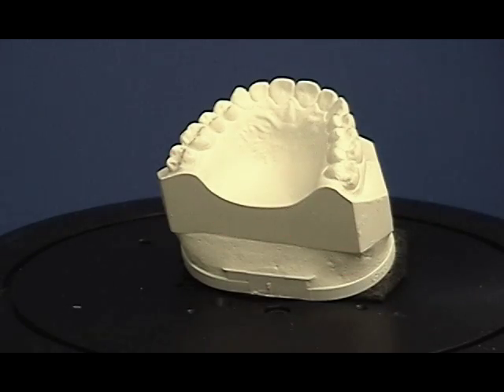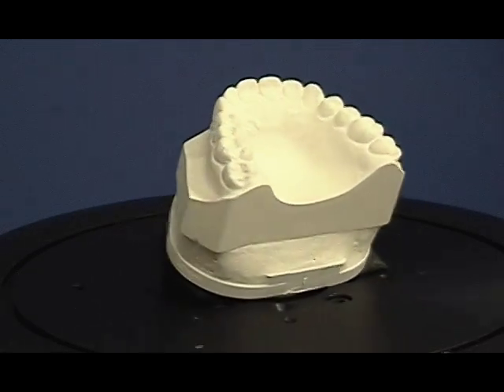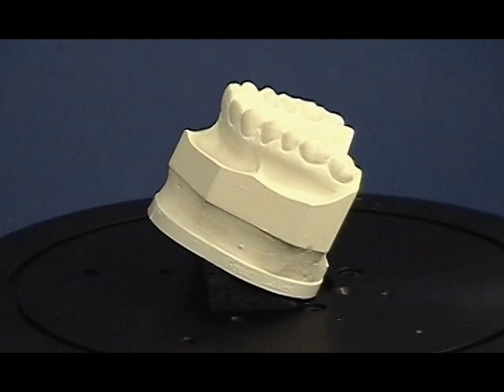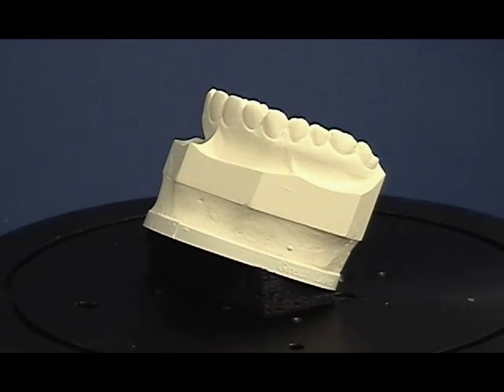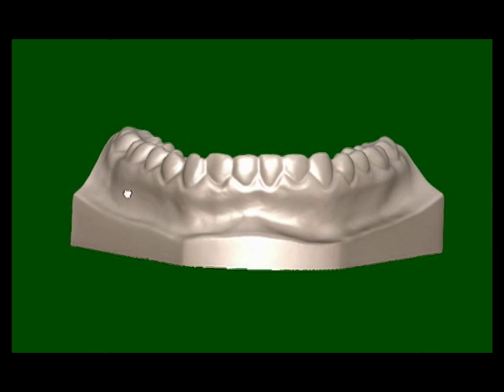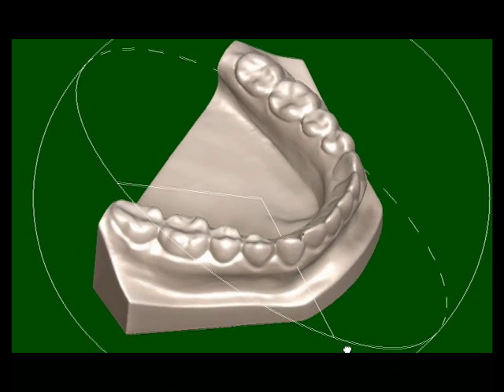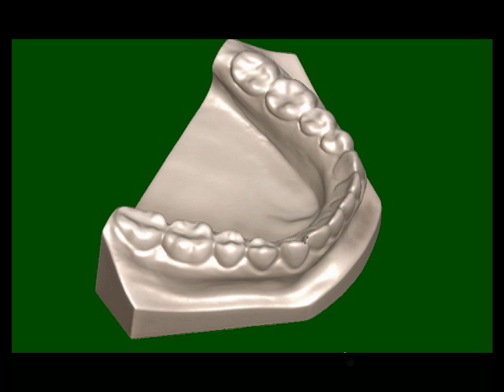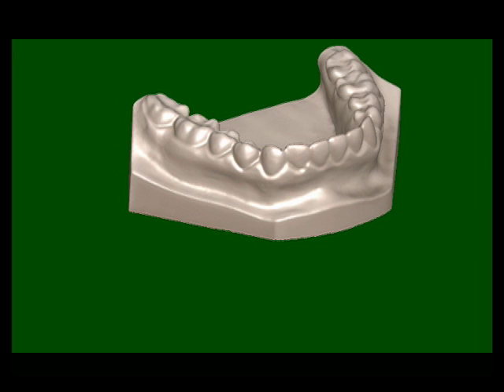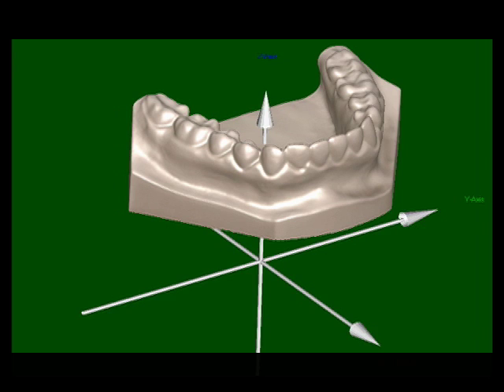The process starts by laser scanning upper and lower plaster models. This results in a three-dimensional model of the upper and lower arches. The models are calibrated with respect to the mounting plate. This allows them to be accurately positioned and moved as they would be on a standard articulator.